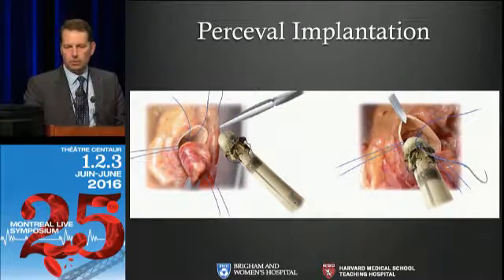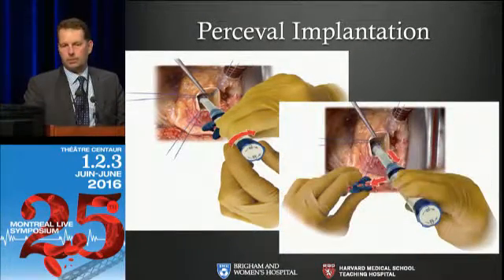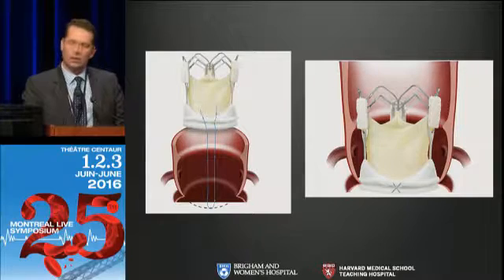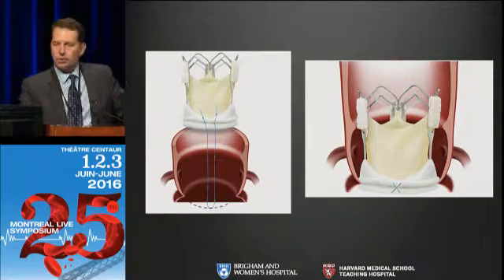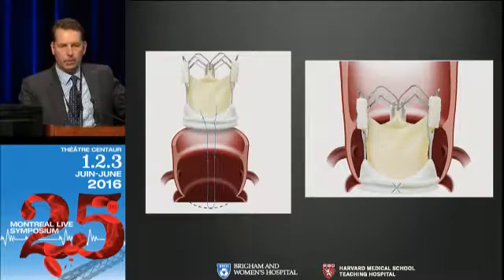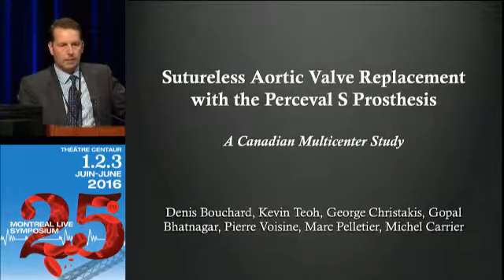Once it's passed, you lower the valve down into its proper position and simply twist the dial to deploy the valve, take off the clip, pull back the valve, and it's fully deployed. You can then distend it or not distend it. The Medtronic Enable valve is a valve that has mainly 1 suture, and that comes again collapsed and is a valve that self-expands when you heat up the valve, and 1 suture keeps it in place.